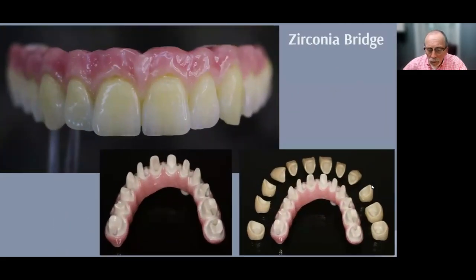And then we moved into more of a zirconia restoration, and this is still the most common all-on-X restoration, and that is a solid zirconia piece. But that's problematic as well. That's a big chunk of zirconia, and zirconia, if you don't know, is milled in a green state and sintered in a very long cycle at very high temps, but with very specific ramping up and ramping down of those temps, because it has to heat up and cool down at a certain rate, or it generates cracks and it warps, and it's a challenge.